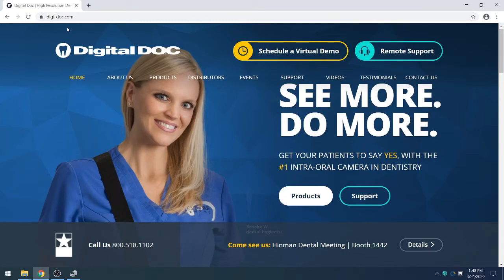Hello and thank you for choosing DigitalDoc for your intra-oral camera needs. Today we will be installing the Iris X80 for use inside of DEXIS 10.